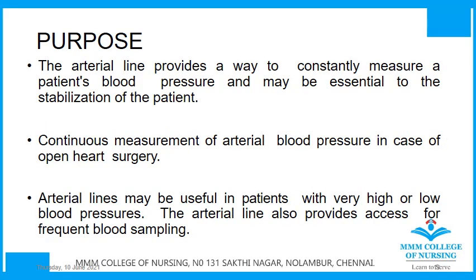What is the purpose of inserting an arterial line to a patient who is very critical? This provides a very clear, constant measure of the patient's blood pressure, and this is very essential to stabilize the condition of the patient. This is the ideal purpose, and this gives you a clear picture.